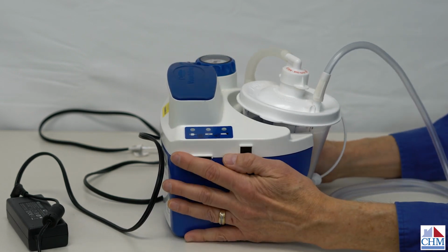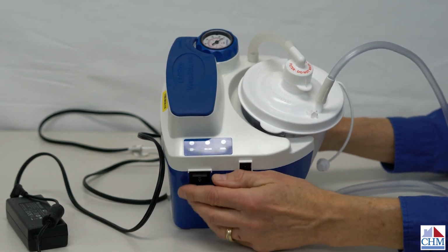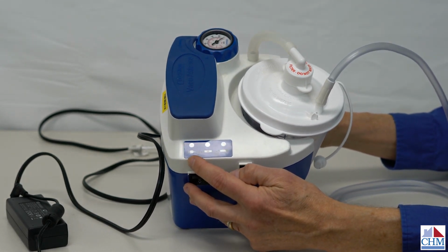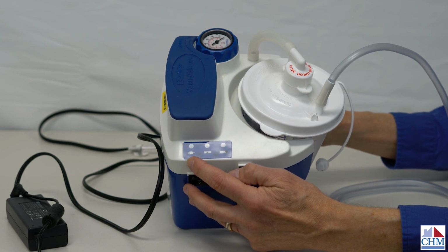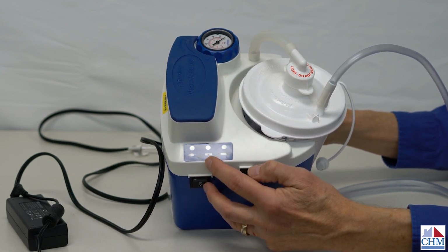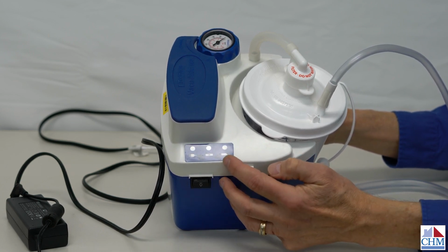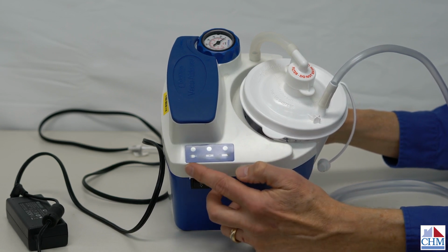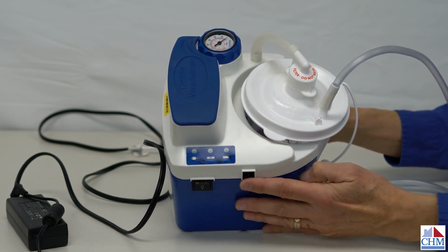It has 3 indicators on a panel here, and it indicates if it's plugged in. The light will come on to show you that you actually have power going into the unit to charge the battery. This indicates that the battery is actively charging, and this indicates that it's operating on the battery source. So you've got the 3 different lights right here.